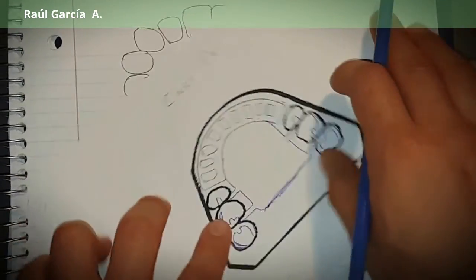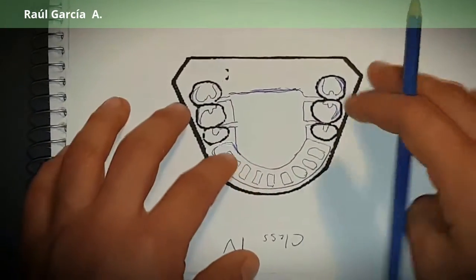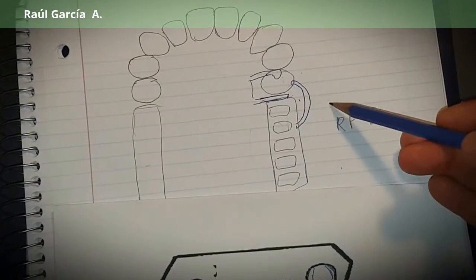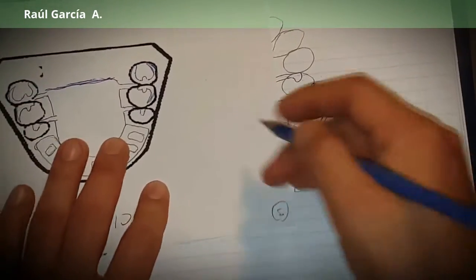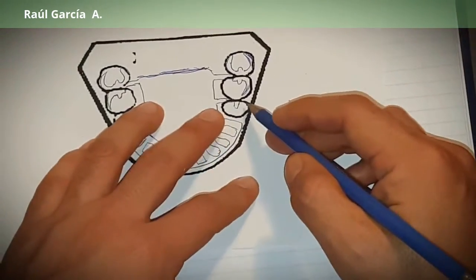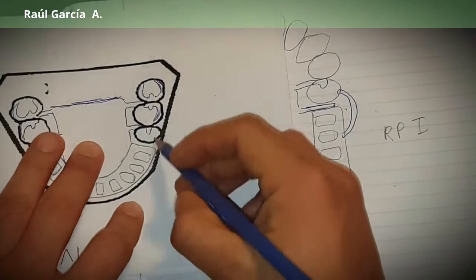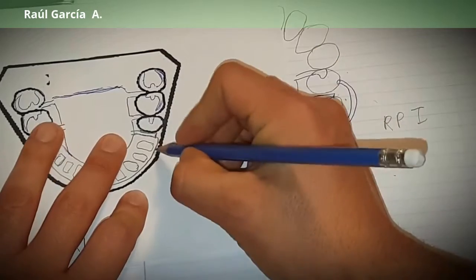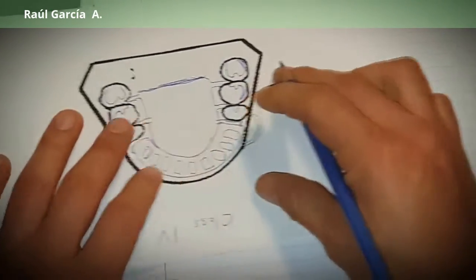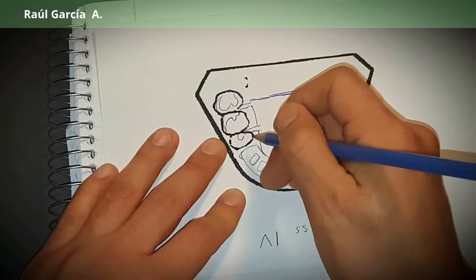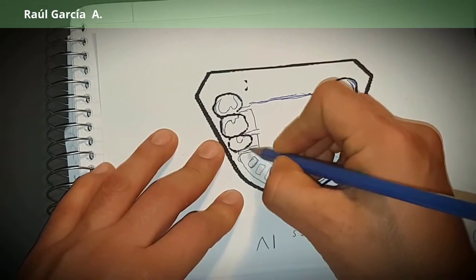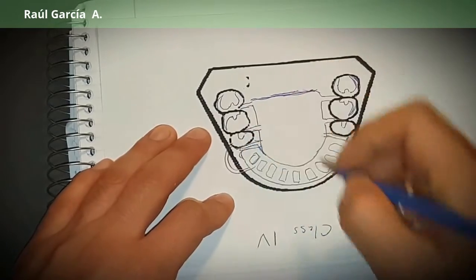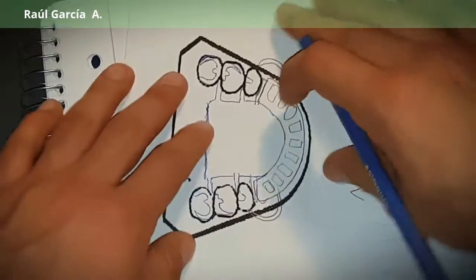Here again we do the same principle. We see that we have two saddle areas here. We want to replicate it here. So mesial rest, guide plate, that's a guiding plane, I-bar. Same here. Guide plate is guiding plane, I-bar. We already put the mesial rest. We turn it around.